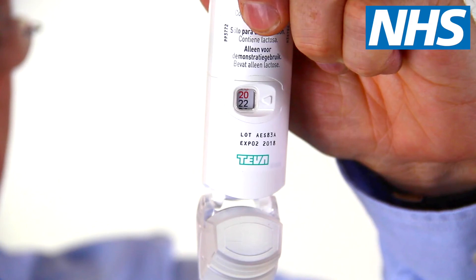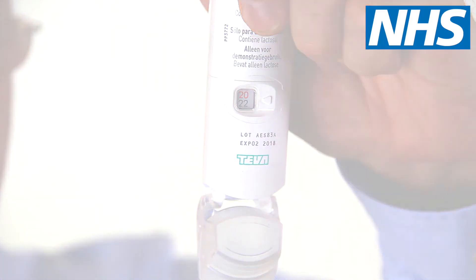There's a counter on your inhaler to show you how many doses you have left. The number will turn red when there are less than 20 doses remaining. You should order a new inhaler from your GP at this time.